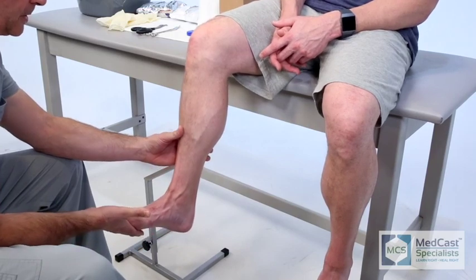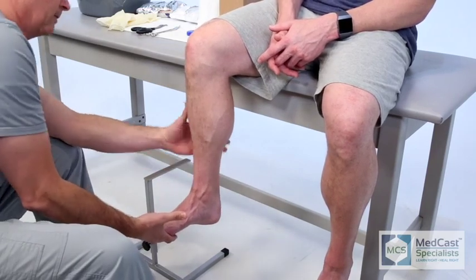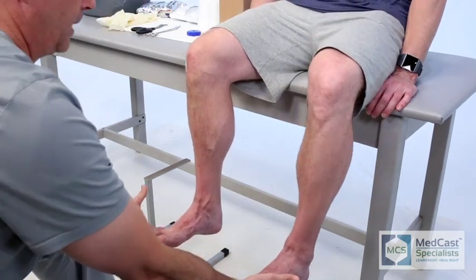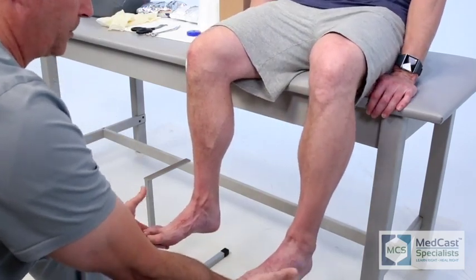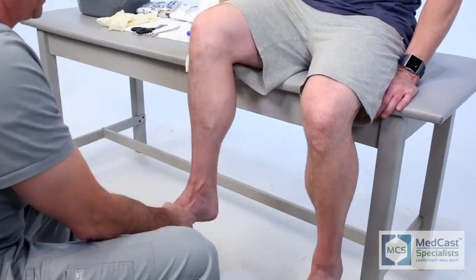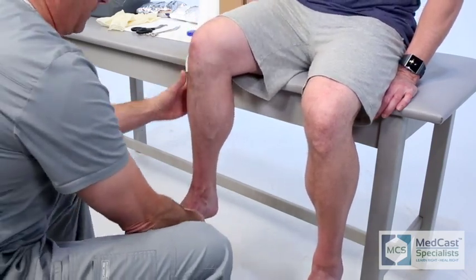In this video clip we will demonstrate a short leg cast. These are used either non-weight-bearing or weight-bearing. You can always breathe a sigh of relief when your physician comes up to you and says it's non-weight-bearing — that makes it a lot easier on you.